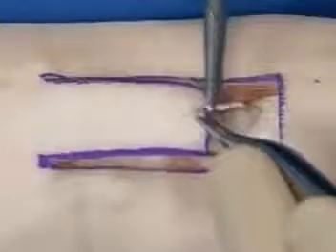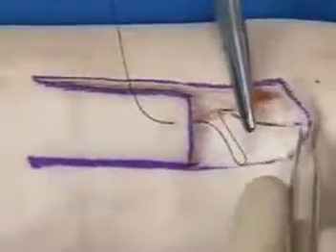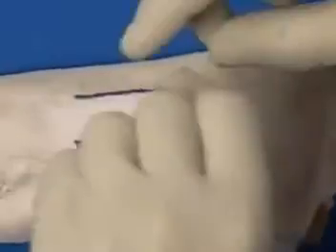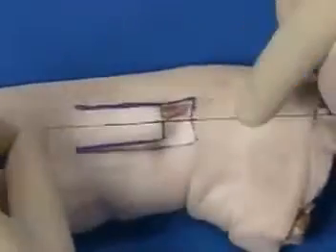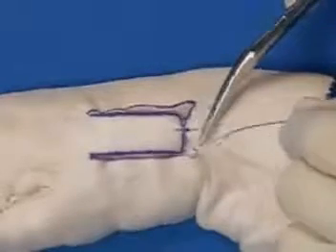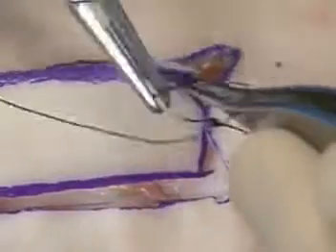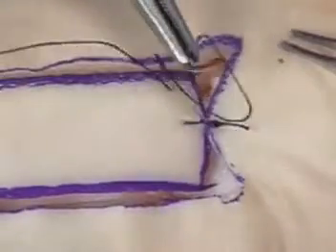The first suture is placed in the center of the flap and out the central aspect of the defect. This is tied with a hand tie and a surgeon's knot to prevent slipping of the knot. By keeping constant tension on the sutures, one can prevent tying an air knot. The suture is cut with a small tail that prevents unwinding of the suture material over time.